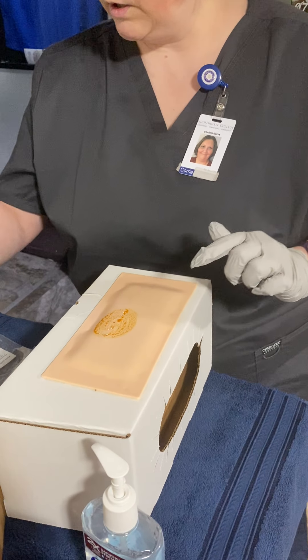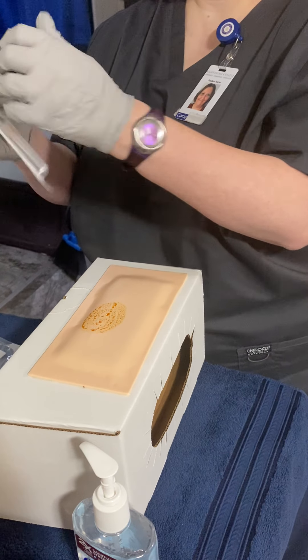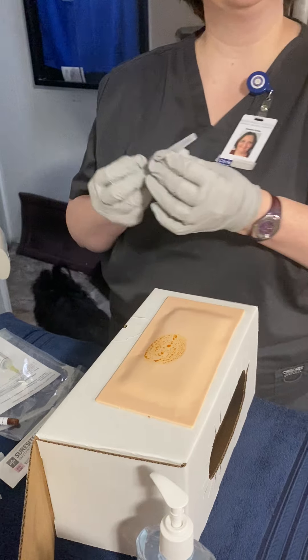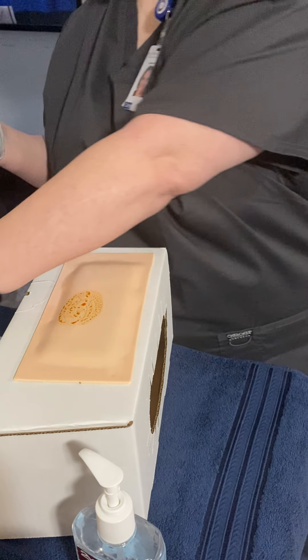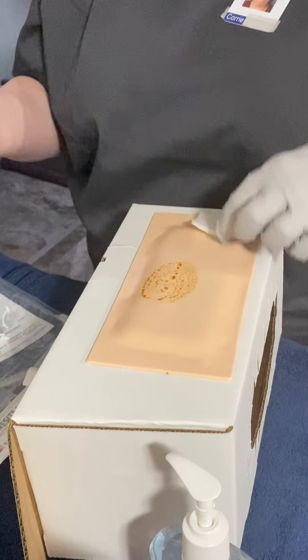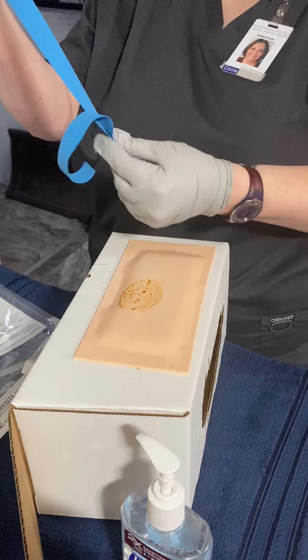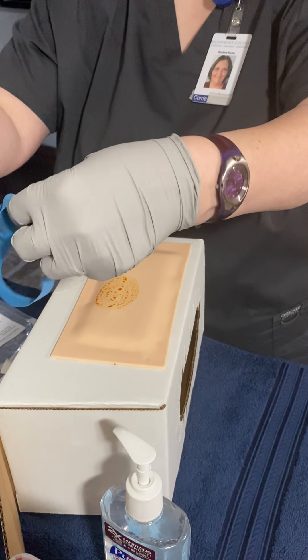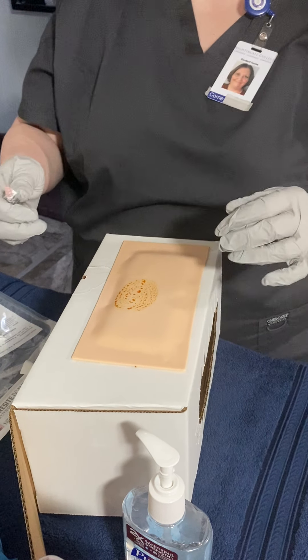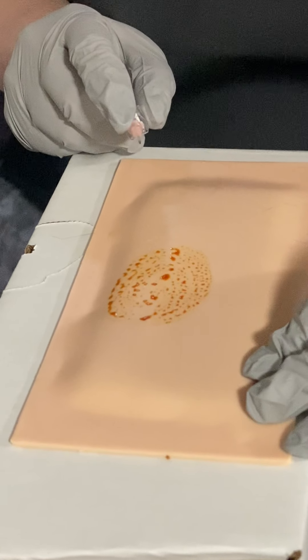This is my IV insertion catheter and it is a 20 gauge that I'm going to use for this procedure. I'm going to take this cap off and put my tourniquet on the patient. When I went to find the vein the first time I did have the tourniquet on the patient, so I'm just going to wrap it around — not too tight — and it will stay on until I have the IV in place. When I go to do this I'm looking for my bevel, and my bevel will go up when it goes into the arm.